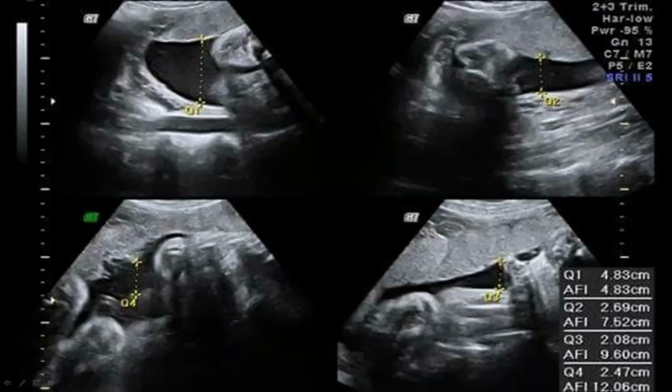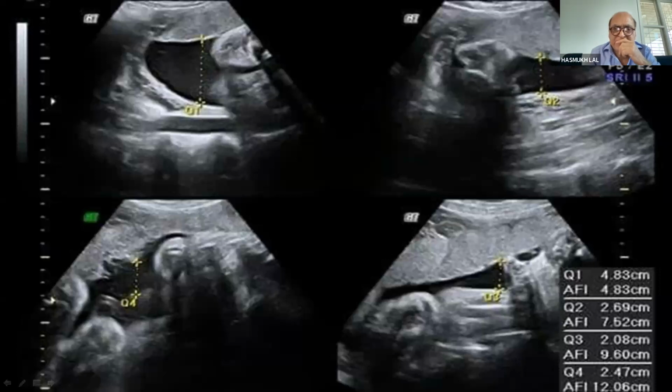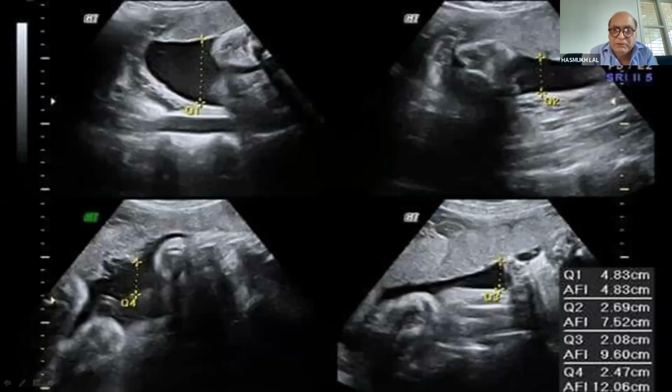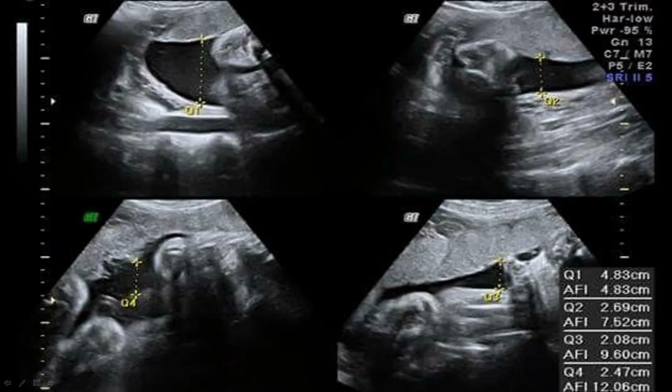Okay, next question. The 6-step sequence of second and third trimester USG examinations. I think these 6 steps are already very systematically described. The first part was the presentation, second is the cardiac activity, number of fetuses, placental localization, amniotic fluid volume, and biometry was the last. So I think D is the correct answer, and 74% people have answered that. There is a significant improvement from 27% to 74%. Very good. Participants have done well. You have listened to Ajit sir, and Ajit sir has delivered well.